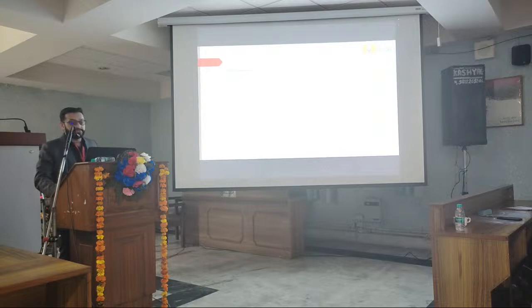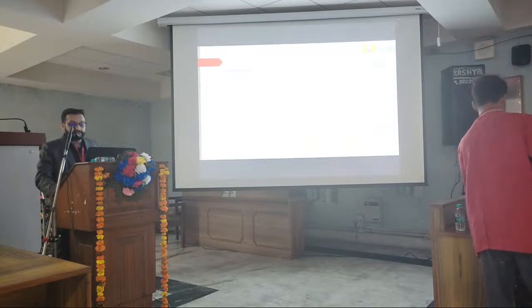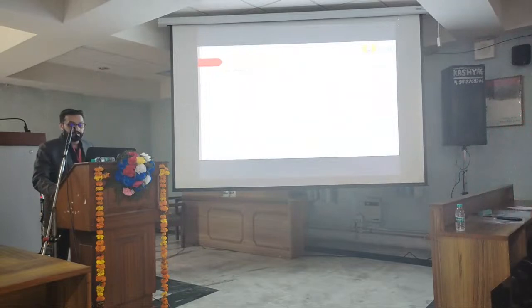So the recommendation is to perform prostate biopsy using the transperineal approach. Due to the low risk of infection, it is strongly recommended. Use routine surgical disinfection. Use rectal cleaning with povidone iodine, those are strong recommendations. And ensure that prostate core biopsies from different sites are submitted separately for processing and pathological reporting.